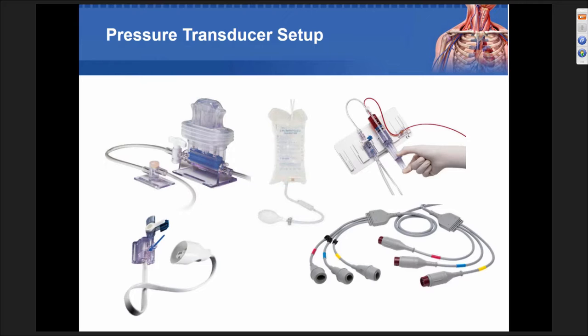So, just to give you some visuals since I'm not standing in front of you and can't see your faces. The bottom corner is the transducer, and that's where you level and zero. And you see the little blue pulley that's right next to the cable connection? That is when I say this needs to be leveled to the phlebostatic axis. That is the area which needs to be leveled in that region. Not the vamp, not the bag, not the tubing. But just right there where it has a little blue pulley, that is actually the transducer. That is where they measure the blood pressure, and that's what should be leveled when I refer to that in later slides.